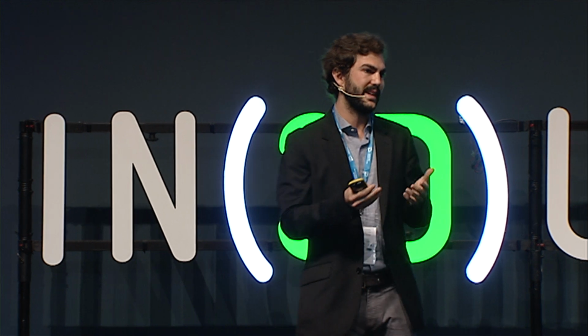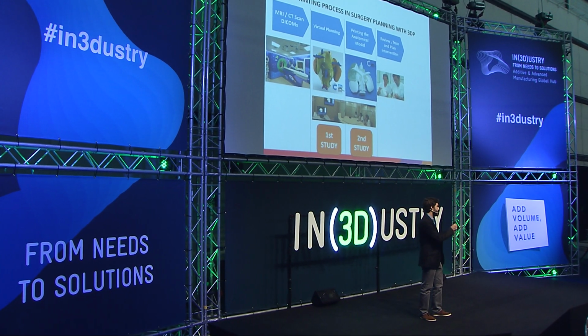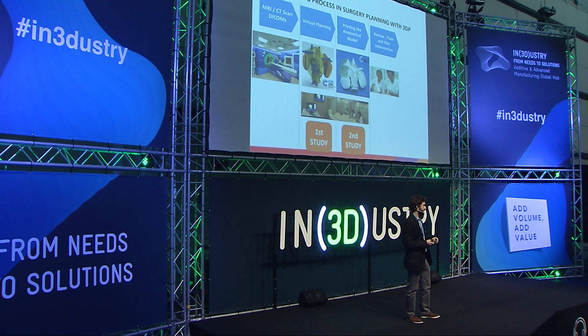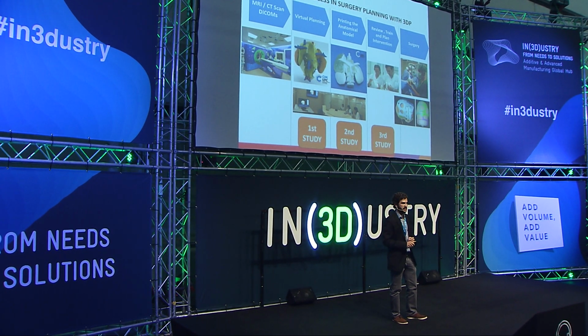Now, with 3D printing, we have 2 more steps. We have the MRI and the CT scan, but then we have to create the 3D design. With that design, you can print the first models and have a second study, all that with the surgeon, the radiologist, and the engineer. Then you create any other piece that can help the surgery, for example, cutting guides that guide how to enter the body of the patient, or positioning guides to place the pieces, for example a replacement piece or another kind of material. And after that, they enter into surgery.